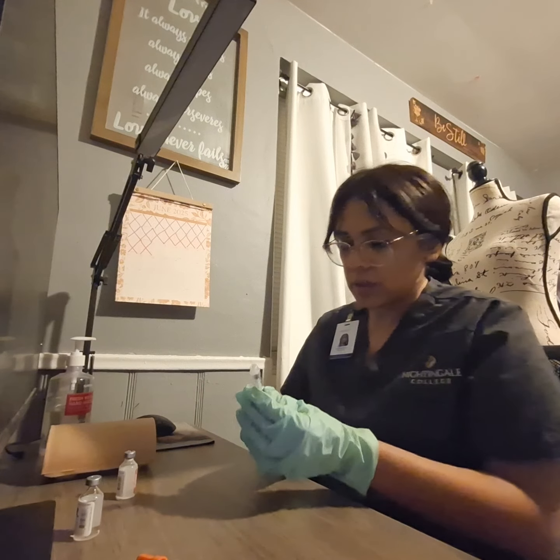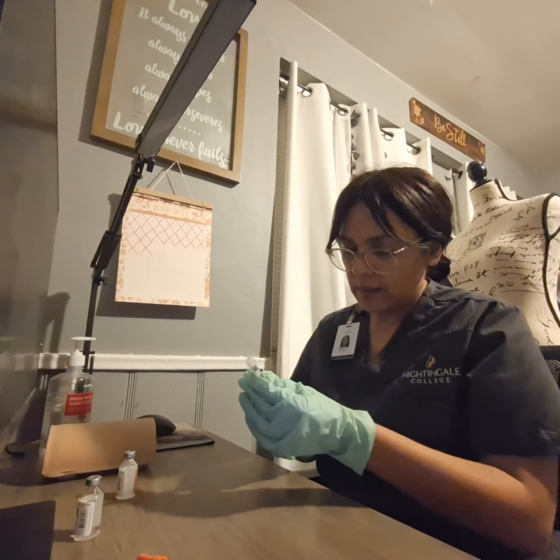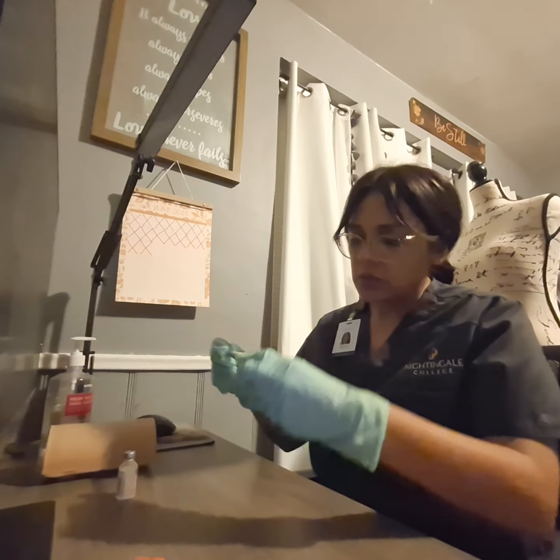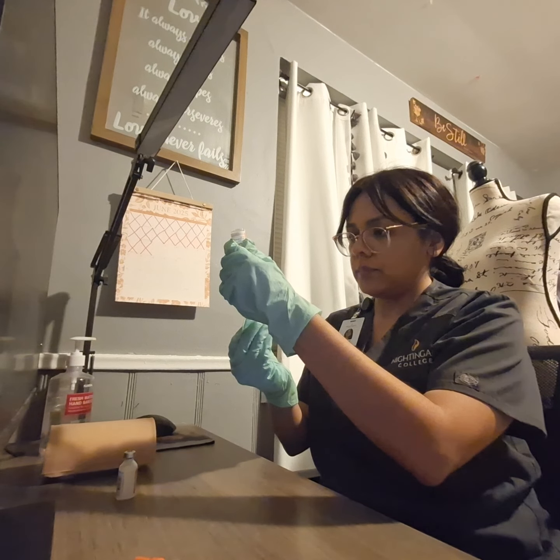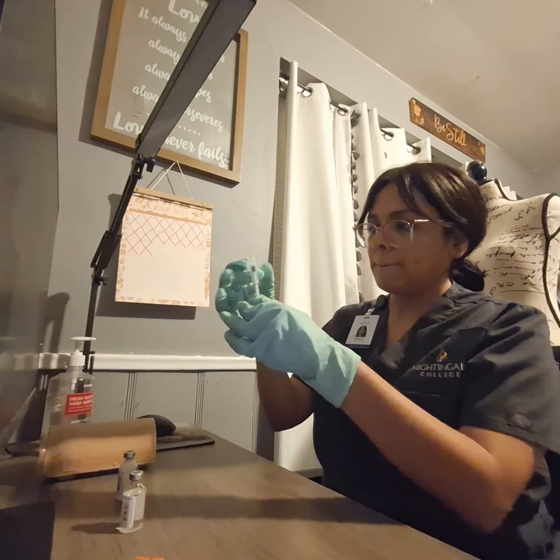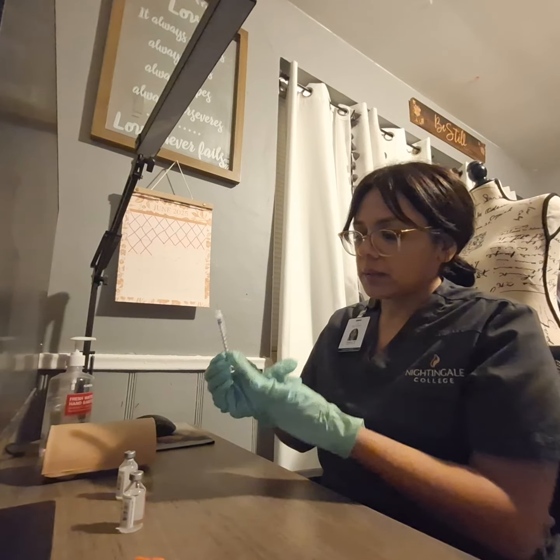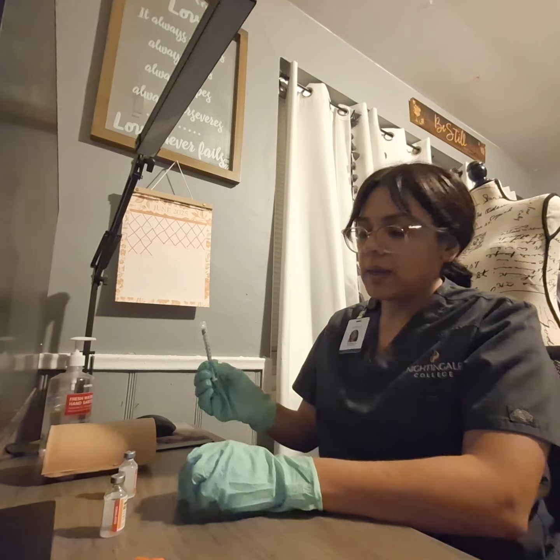So the next thing, we're going to pull 4 units here of air. We're going to inject it here to our regular insulin and draw the 4 units of regular insulin here. All right, so I'll make sure to get rid of the bubbles here. And as I'm doing this, I'll verify that I have the 4 units here of regular insulin in the syringe and verify that I took it from the regular insulin here.